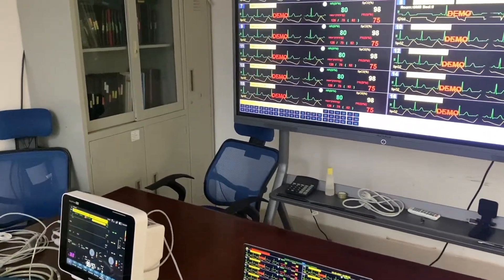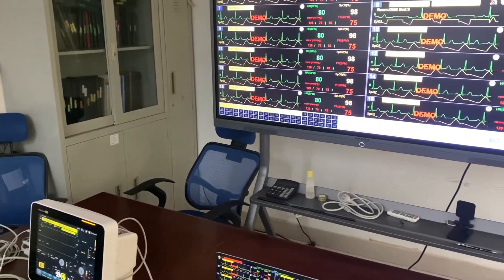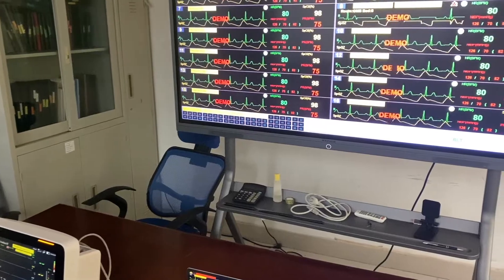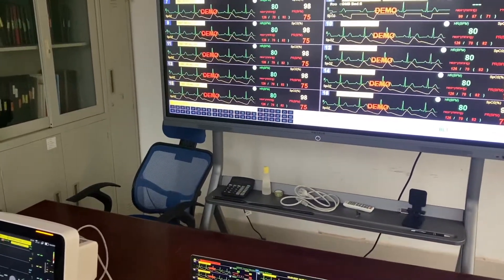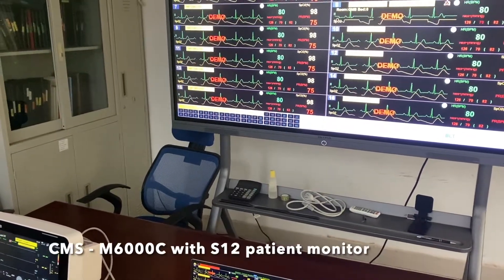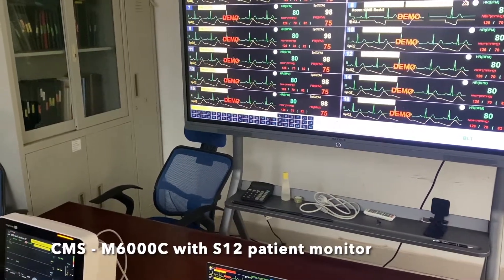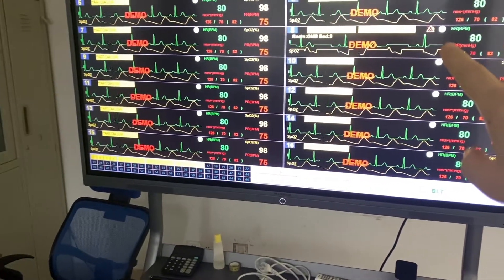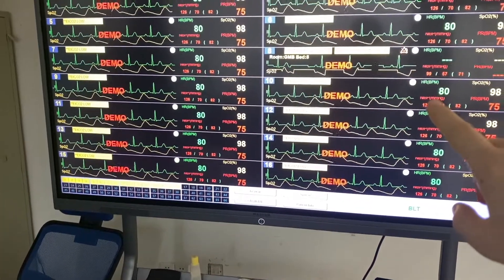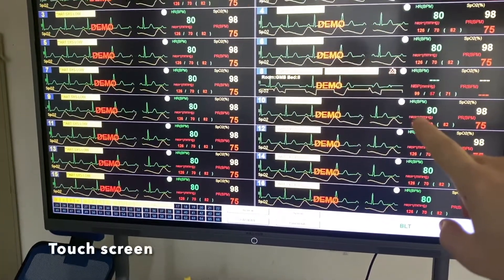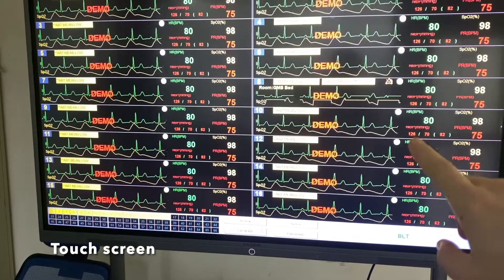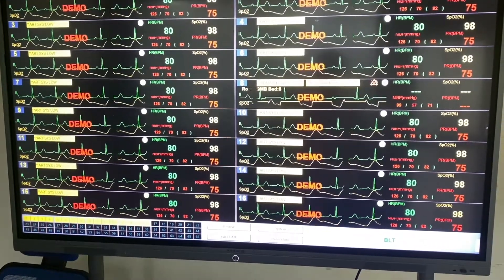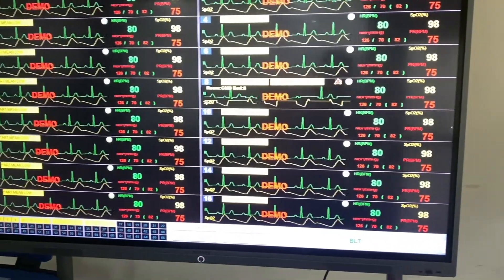Hello everyone, this is the introduction from BioLite. My name is Jimmy. In front of you is the central monitoring system and we have a touch screen CMS display screen over there, which is running a demo for the patient monitors.